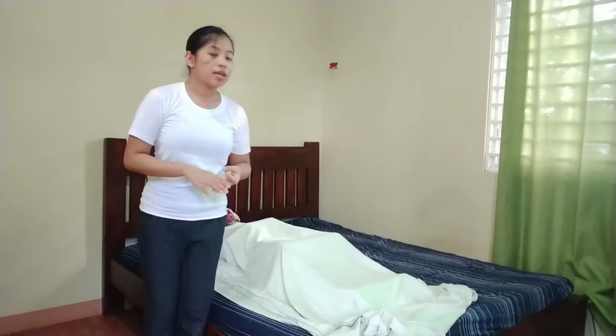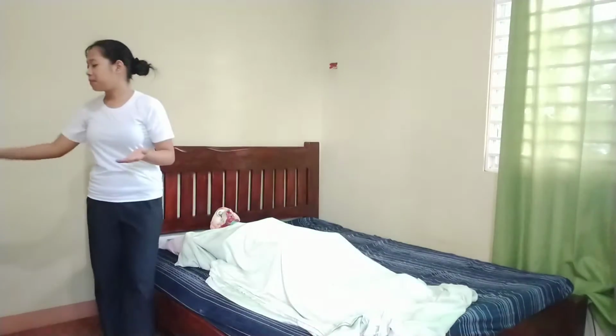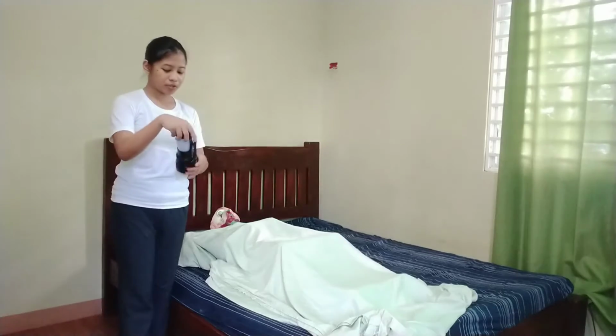Now, for the planning, I will prepare the equipment I will be needing. So I will need a perineal flushing set, my perineal lamp or the heat lamp, and a blanket. After that, I will also check all the electrical equipment, whether they are working properly. So I will try to switch on and off my perilite or my heat lamp. So I will test it.